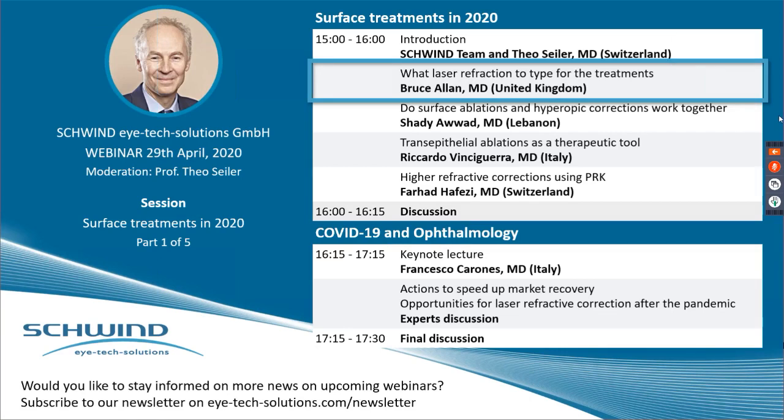Yeah, I have another question, just for the record. To Sam maybe, if you do a corneal wavefront, does this include information about the back surface of the cornea also, or does it include only the anterior surface of the cornea? Thank you, Theo.